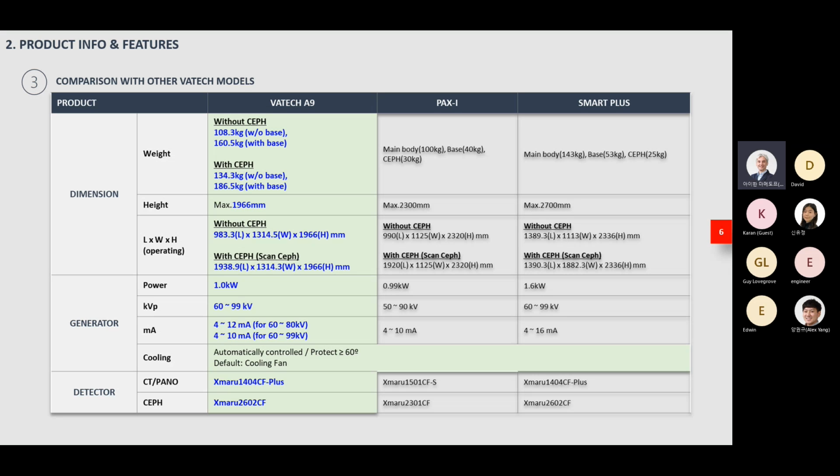So what you get from here is that you have a 3D device with functions as on a 3D device, but some specifications, like physical hardware specifications, are closer to the 2D. Like it's lighter and easier to install compared to the other 3D devices.